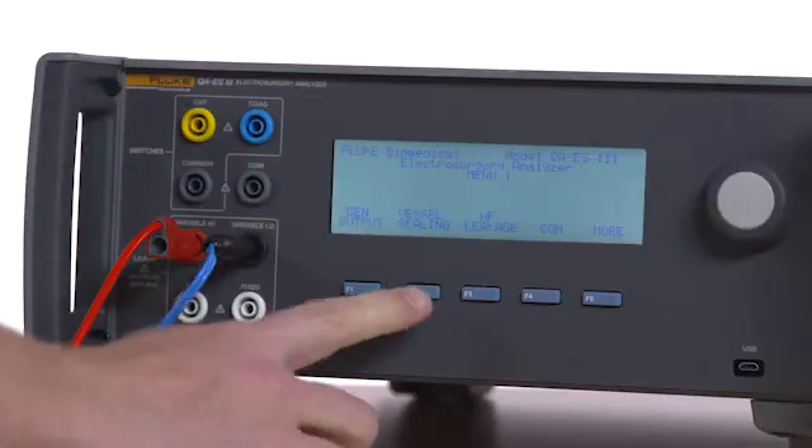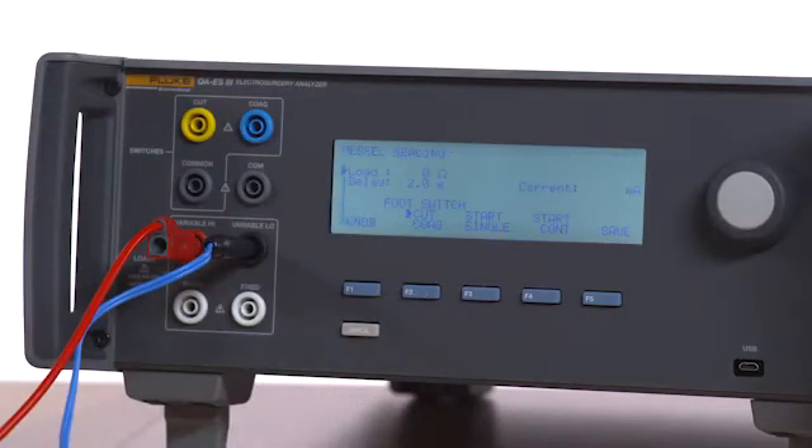Press F2 on the QAES-3 to enter vessel sealing mode. Select 0 ohm load.